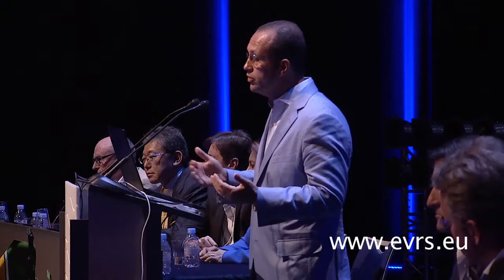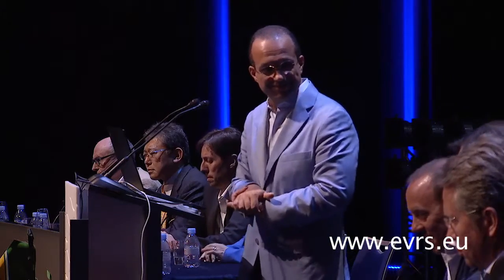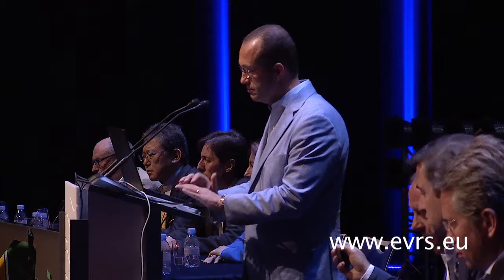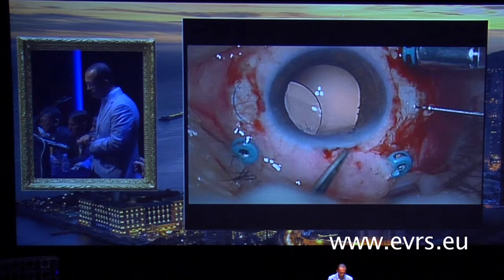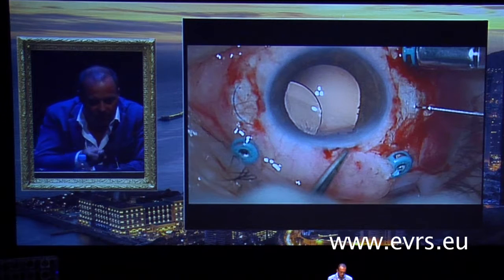And we're going to continue with the theme of IOL fixation, and Fabio is going to show us his technique. That's not my technique, but it's a technique that I try. So can you stop the video here for one second? I choose this technique because I found several difficulties during the normal technique of intrascleral IOL fixation.